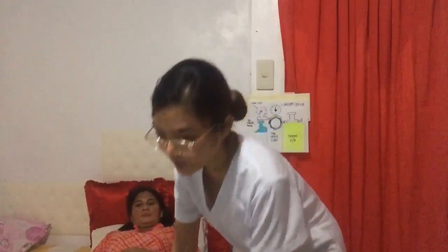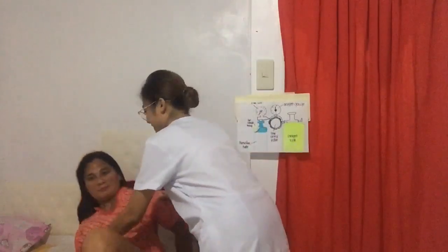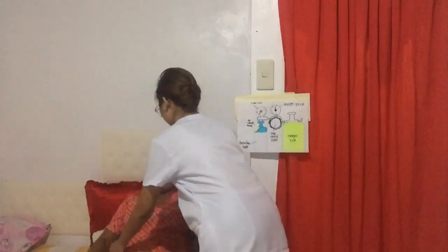So mamaya po, gagamit tayo ng nasal cannula. I want you to breathe po gamit ang iyong nose. Okay? So, I will assist you, ma'am, to the high Fowler's. Ito po. Okay, so my patient is in the semi-Fowler's position.